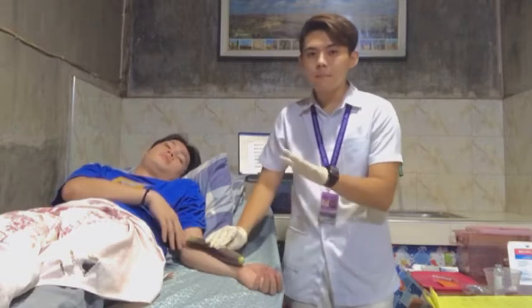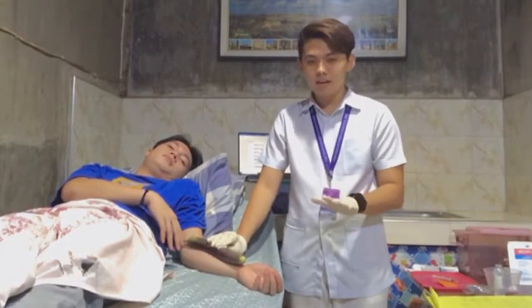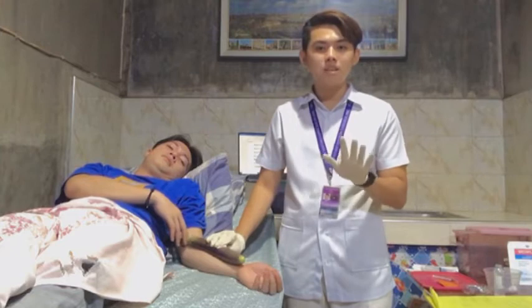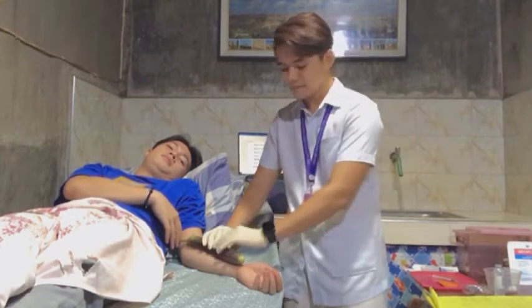Of course, pat using a dry cotton ball and do not massage the area. And of course, after that, encircle the wheal with a blue or black pen and instruct the patient not to rub the wheal or erase that mark.